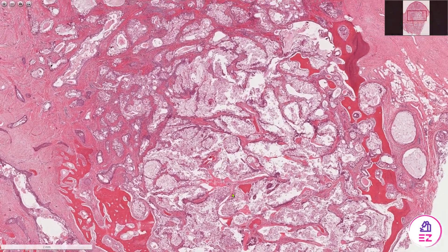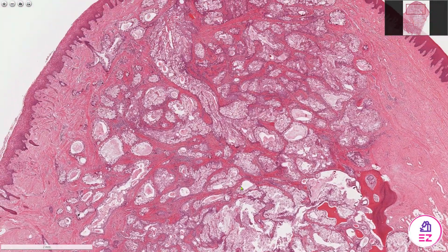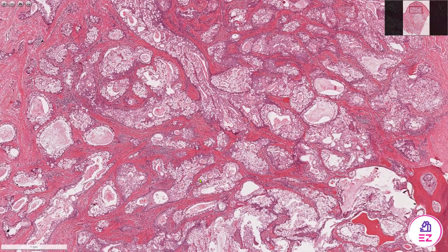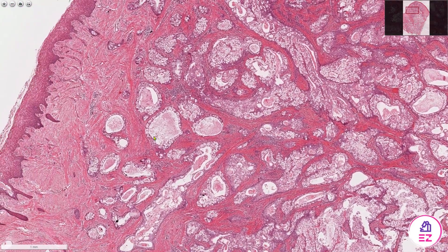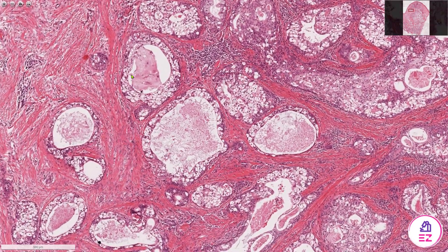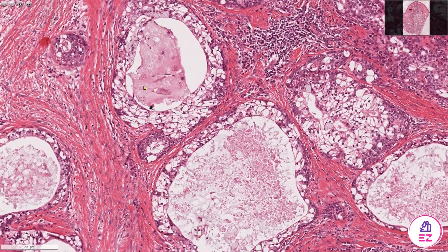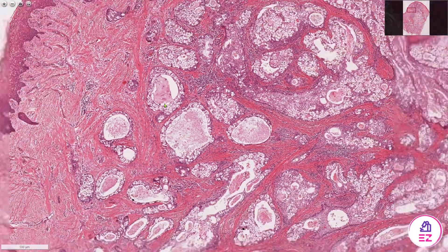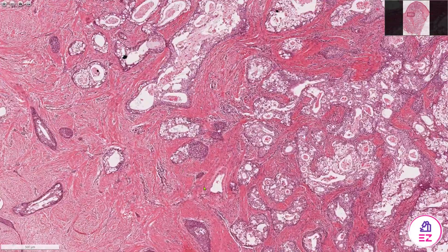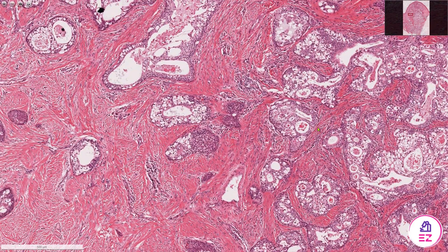Generally, mucoepidermoid carcinomas have a mixture of solid and cystic components. We can see multiple cystic structures and some of them are filled with mucinous material, and in other areas we have more solid nests as well, but even some of these have smaller cysts within them.